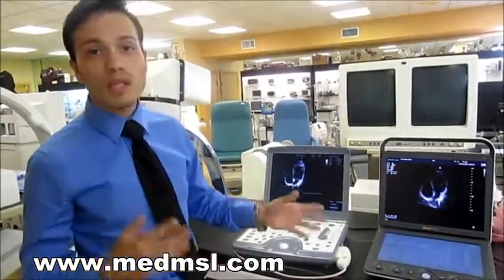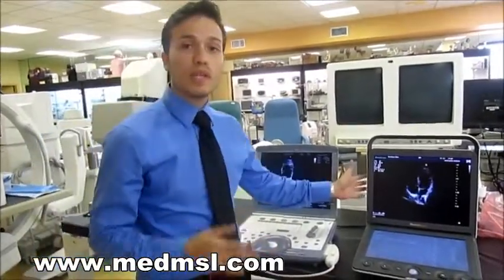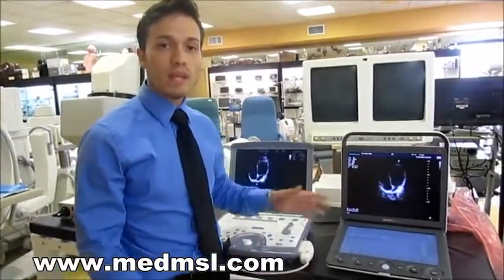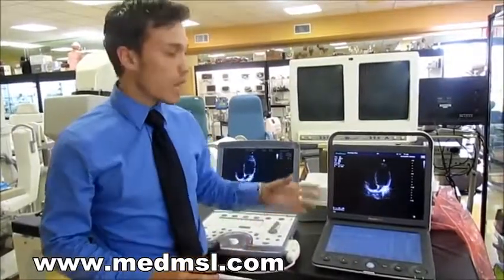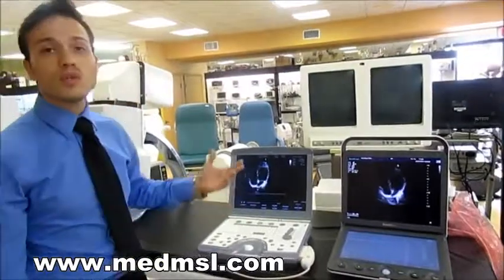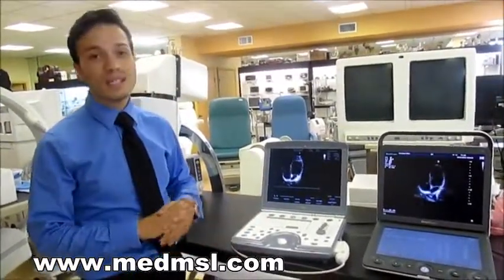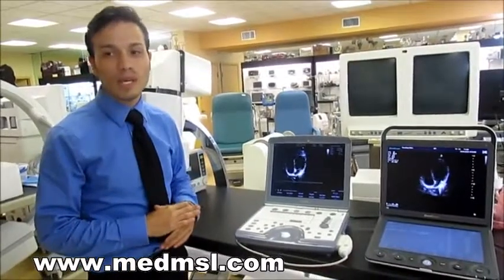If your ultrasound ever goes bad and you need help from GE, GE will not help you past a certain point. With Sonoscape, we are dealers and technicians for them, and we do all repairs on site — everything from simple help to actual repairs. With GE, you have to purchase a service contract, which is going to cost you a decent amount of money.